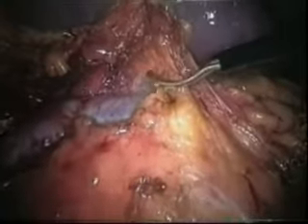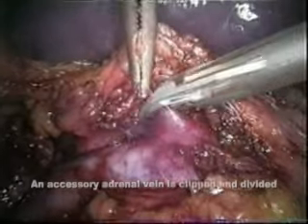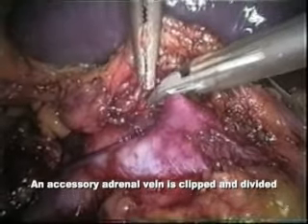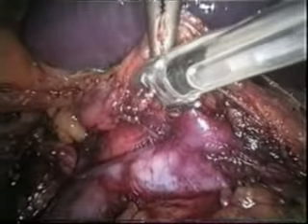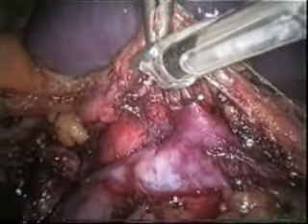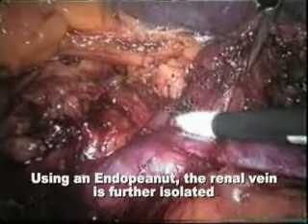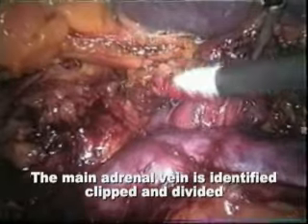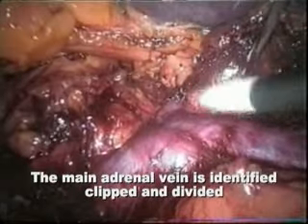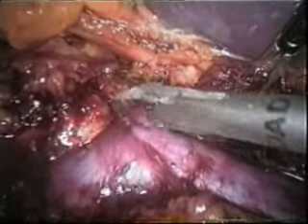In this case, an accessory adrenal vein is clipped and divided. 5 mm titanium clips, 2 proximal and 1 distal of each vessel, are to be used. Using an endo-peanut, the renal vein is further isolated. The main adrenal vein is now identified, clipped and divided. It is advisable to apply again 2 clips proximally and 1 clip distally.